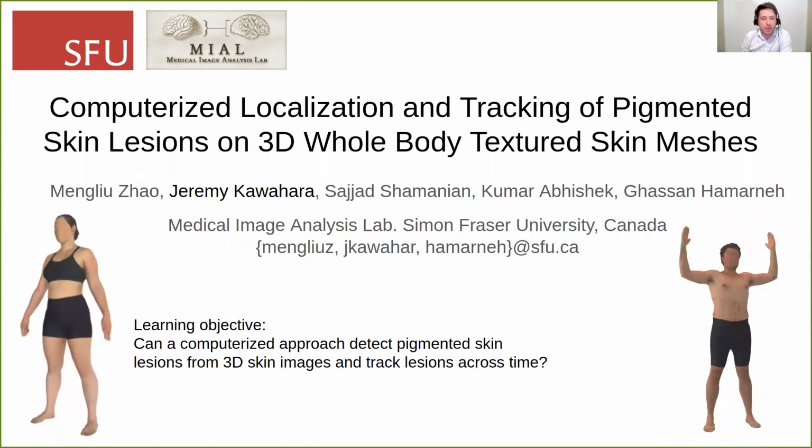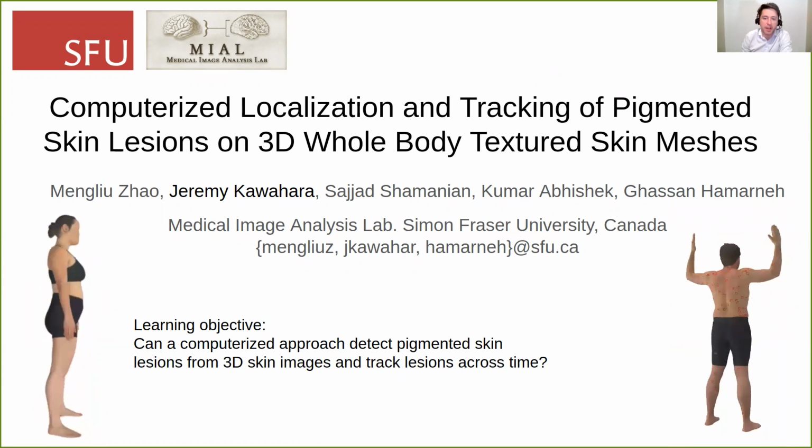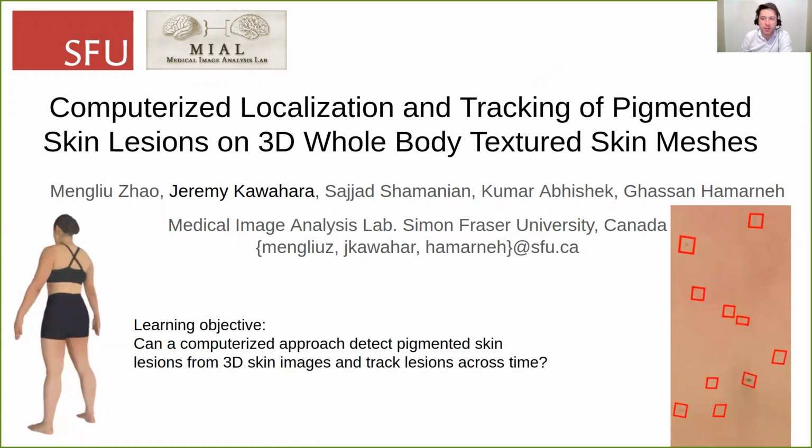And today we'll be presenting our work on developing a computerized approach to detect pigmented skin lesions from 3D skin images and tracking these lesions across time.